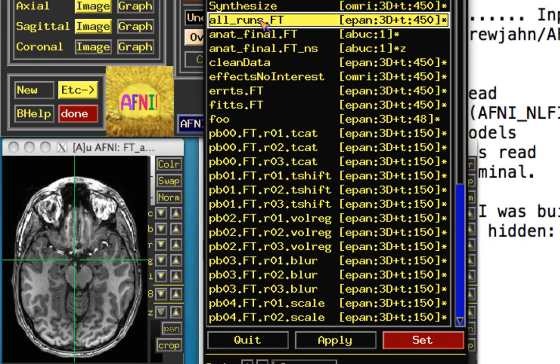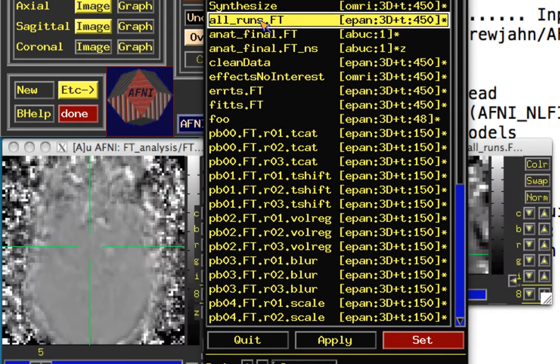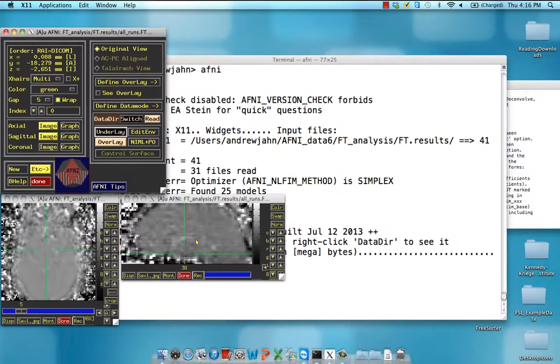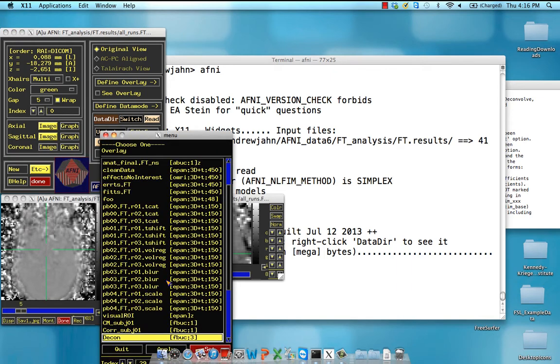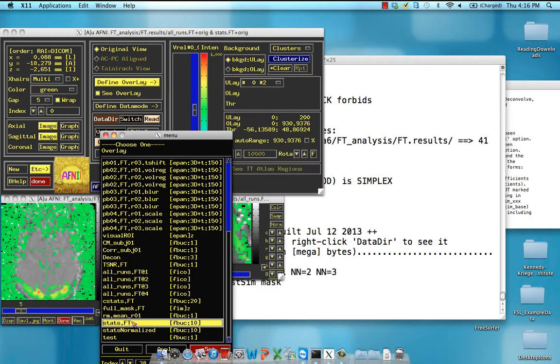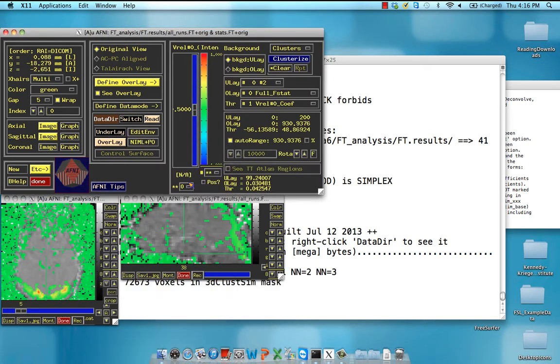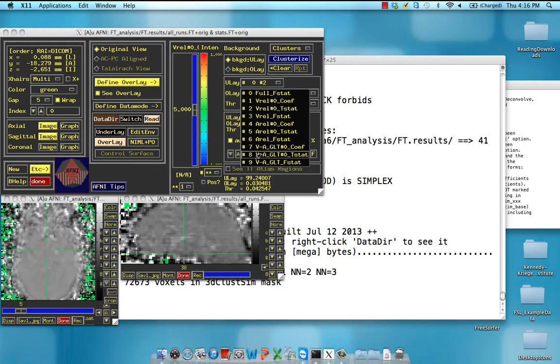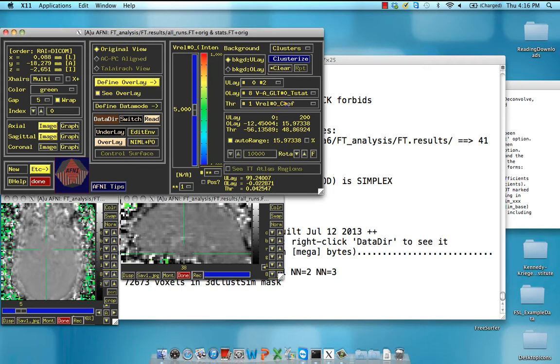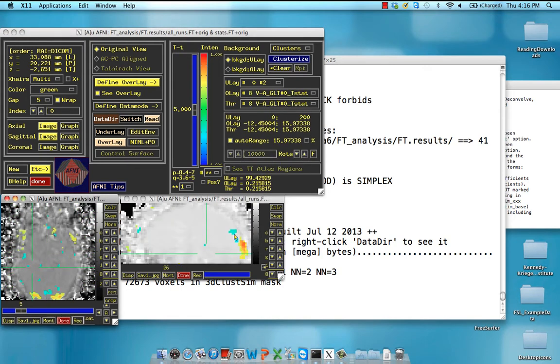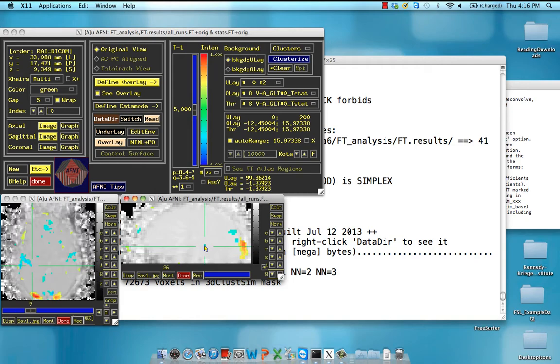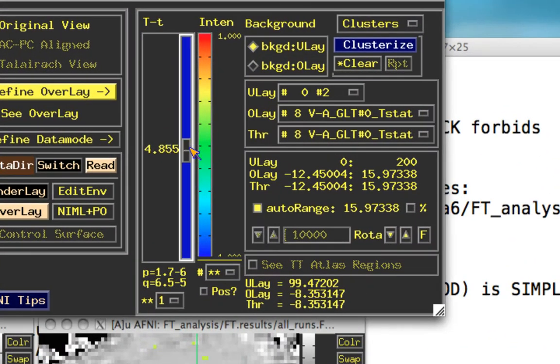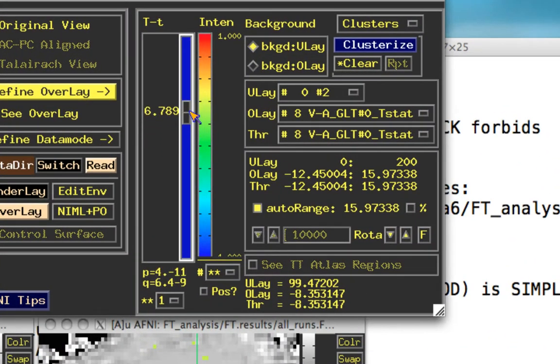Set the underlay as allruns.ft. So here we are, and you'll notice, if you've already done this other analysis, that we have our stats.ft dataset. I'm just going to threshold this a little bit. And for this, I'm going to use the V-A contrast that we had, visual-auditory. And go back to one of these clusters that we had before, after thresholding it appropriately, and doing some cluster correction.